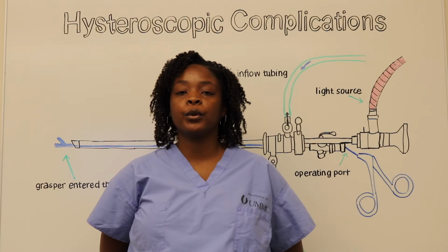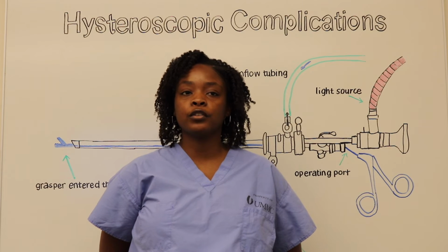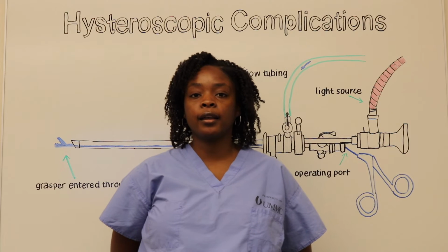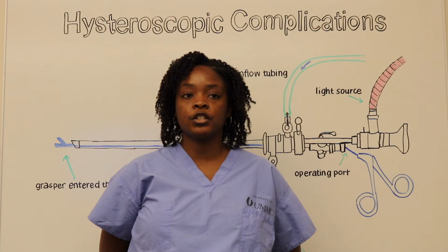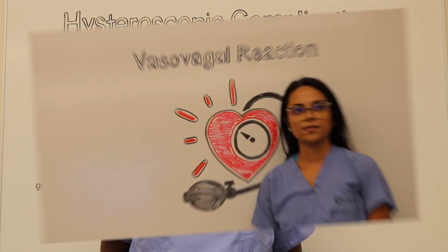Complications that can occur with hysteroscopy include vasovagal reaction, fluid overload and hyponatremia, hemorrhage, uterine perforation, and air embolization. Next, we will discuss the prevention and management for each of these potential hysteroscopic complications.